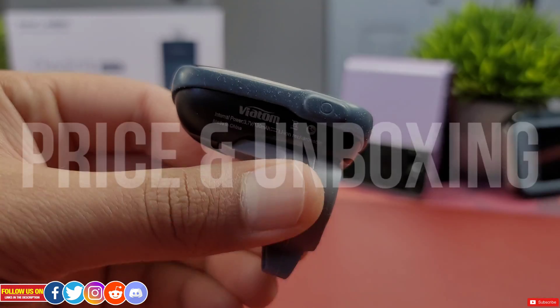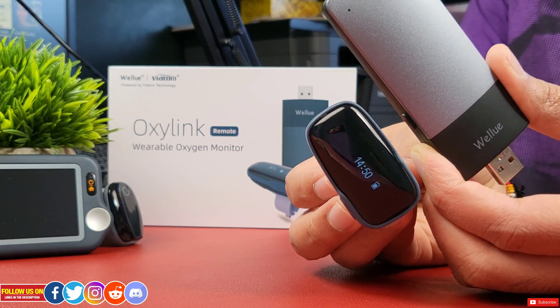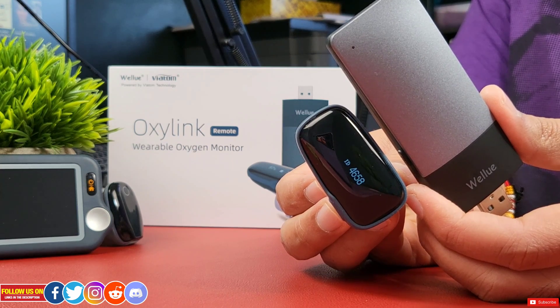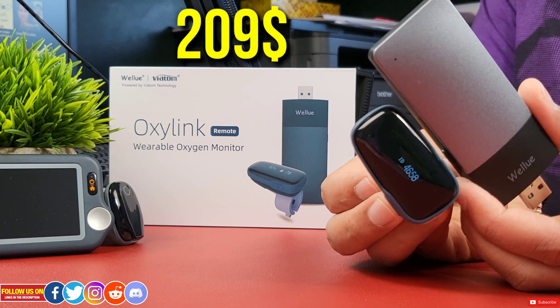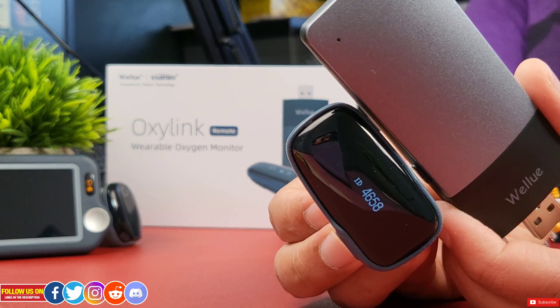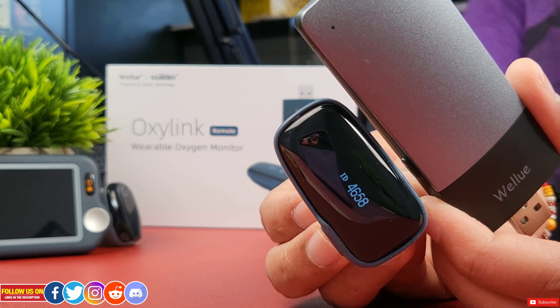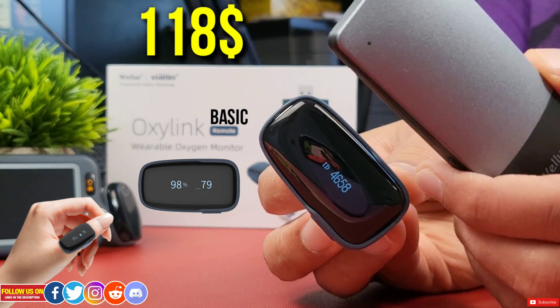Starting with price and unboxing — the OxaLink wearable oxygen monitor comes in two options. The one I have is the OxaLink Remote, which comes with the remote linker and costs $209 USD at the time of filming. There is also a cheaper OxaLink Basic that costs only $118 USD. Check the links in the video description for direct purchase links and any discounts.